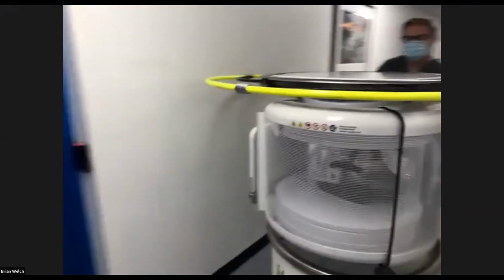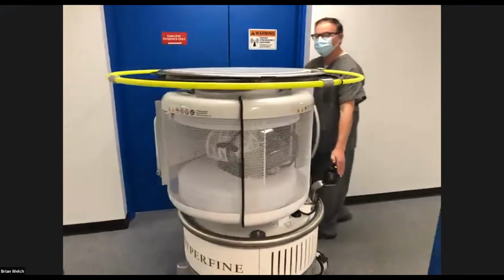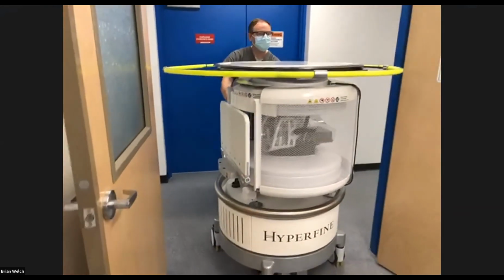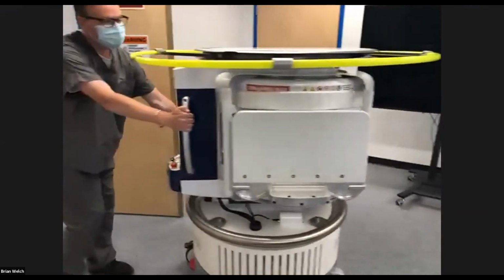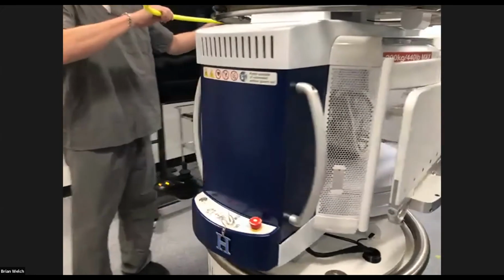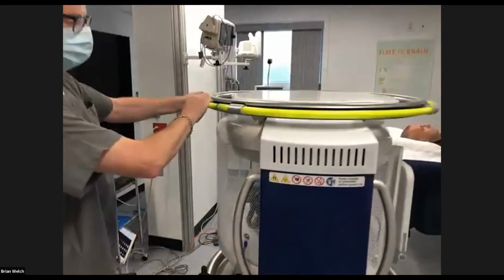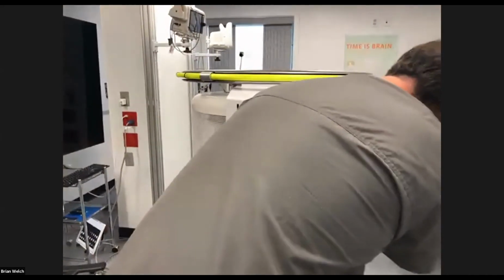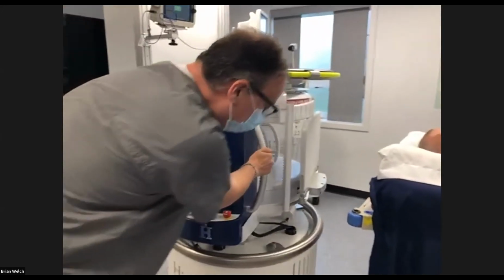It looks like these corridors are even narrower than what you see in hospitals, right? Yep. So easy to drive. Brian has a joystick on the left side of his hand that is controlling it, bringing it to the patient. He's closing the 5 Gauss guard. That's the extension of the 5 Gauss line. So anything beyond that is totally safe. He's positioning it next to the patient's bedside.